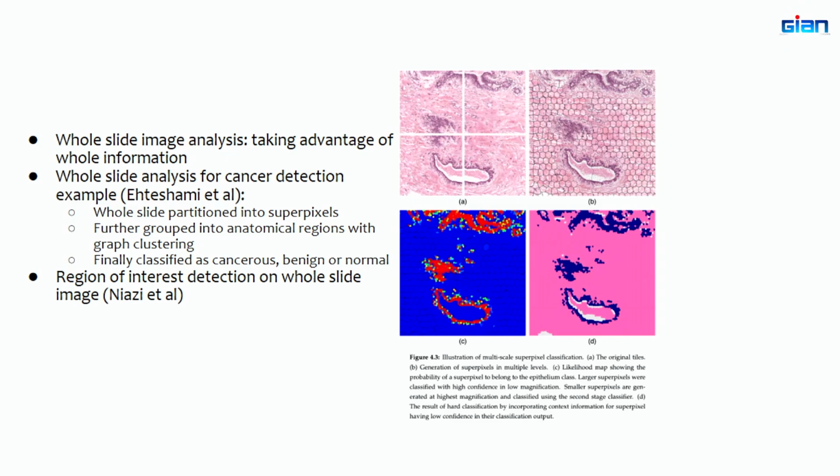So here are a couple different papers. The paper that you see on the right has this concept of super pixel or super voxel. So what does that mean? Pixels are essentially each individual unit of the image, but you can look at pixels right next to each other that share similar intensity information, and you can club the pixels that share the same intensity information into one group. You call it a super pixel.